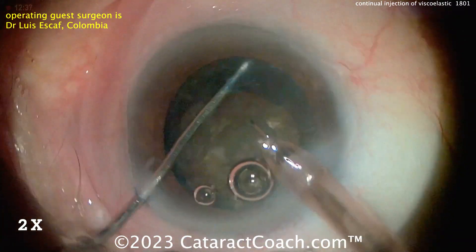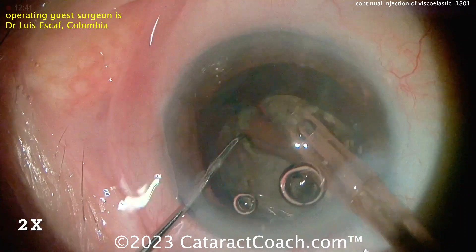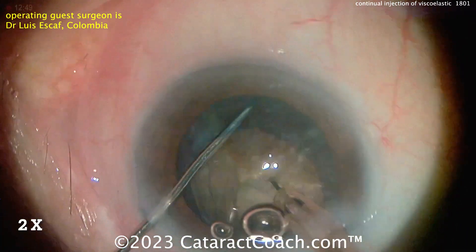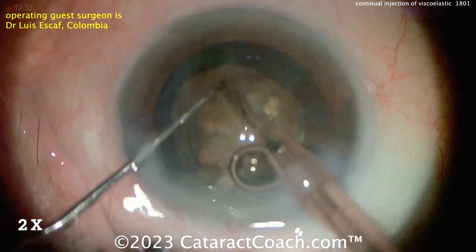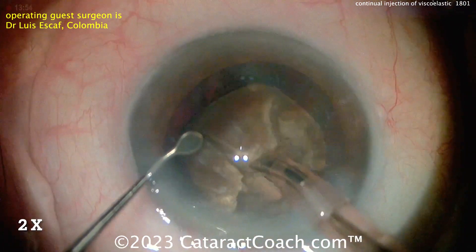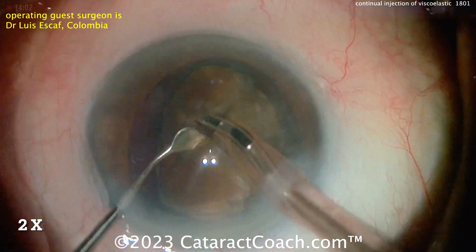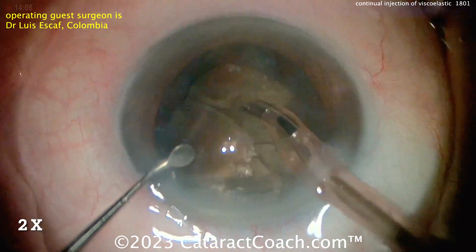The cataract's been split up into many pieces. When we're emulsifying this, again, we want to protect the cornea and we want to protect that posterior capsule. You've heard us say it here before — viscoelastic is cheaper than vitreous. Well, turns out viscoelastic is also cheaper than corneal endothelium. So using plenty of viscoelastic is probably a great idea here.